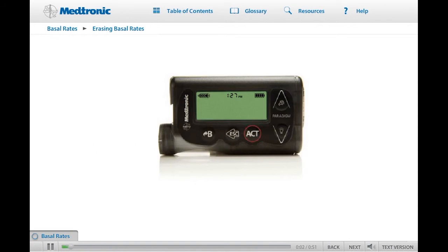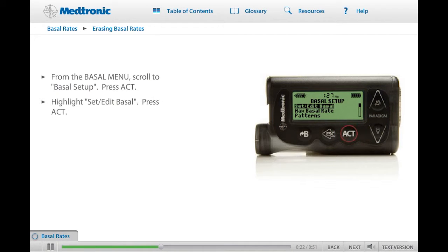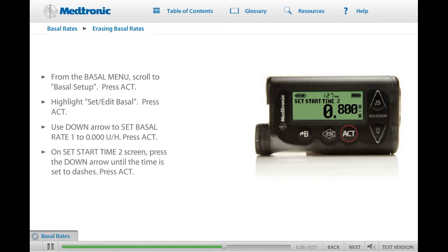If you would like additional practice setting basal rates, the basal rates you just set can be erased. Once erased, you can repeat the practice exercises or make up other basal rates to practice programming your pump. From the basal menu, scroll to Basal Setup and press ACT. Set Edit Basal is highlighted — press ACT and Set Basal Rate 1 appears. Press the down arrow until the rate is set to 0.000 units per hour, then press ACT. When Set Start Time 2 appears, press down to set the time to dashes and press ACT. The current rate screen appears with the 24-hour total reading 0.000 units. Your basal rates have been erased.